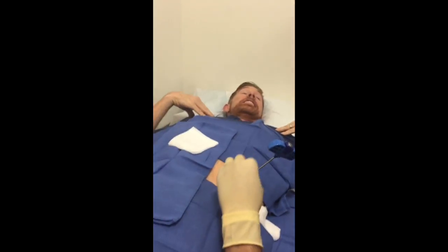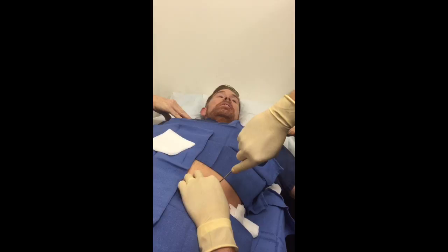Now I got through the cortical plate. You can feel the difference. You can hear the difference too.